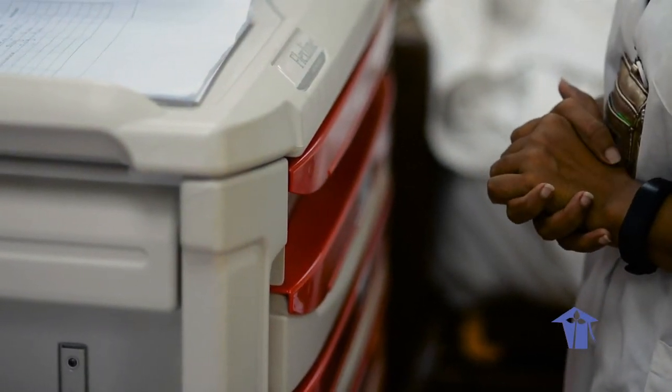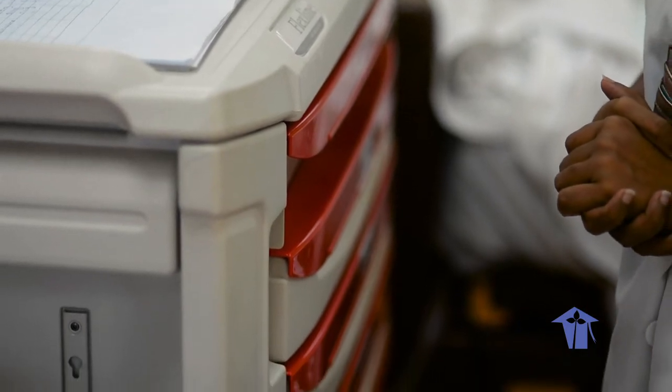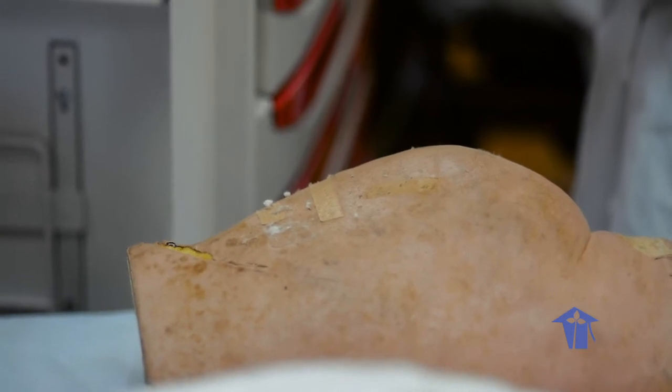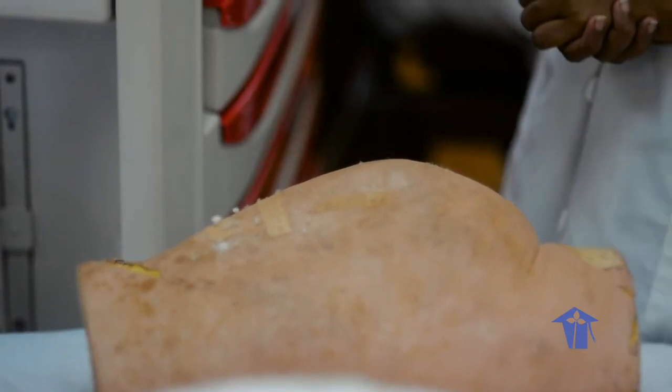Check the name and date of birth on the patient identification band. Ask the patient to state his or her name and date of birth based on hospital policy. If the patient cannot identify themselves, verify the patient identification with a staff member who knows the patient for the second source. This was all done previously. Check the patient allergies or bracelet, or ask the patient about their allergies. This was also done previously.